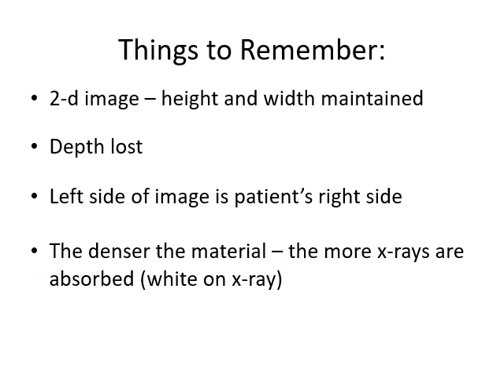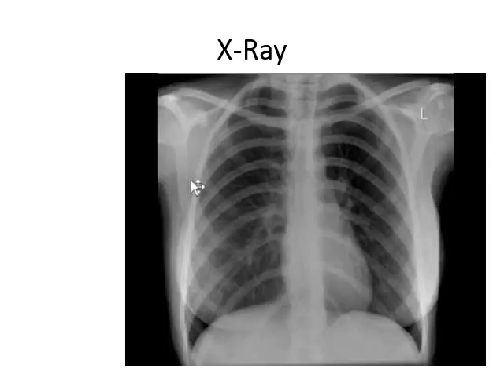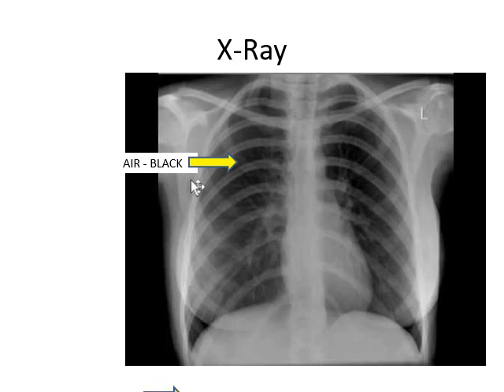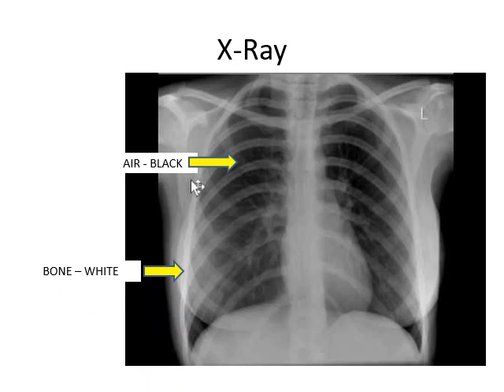Looking at a chest x-ray — here's the left side of the patient, as if this patient is standing towards you. We've got some nice black air in there — that's what you want to see. Nice black lungs. Air or gas comes out black. Bone comes up as an off-white color. And dense tissue like the liver comes up as a darker gray. I've got the circle showing the left side there.